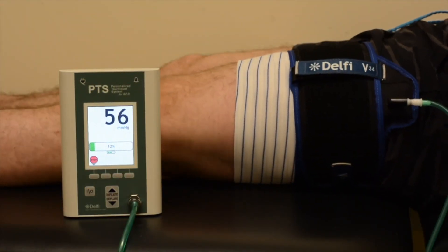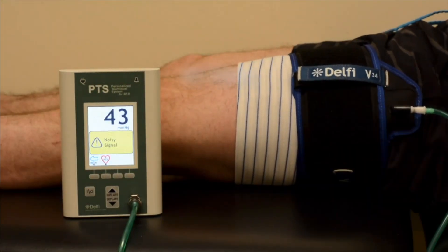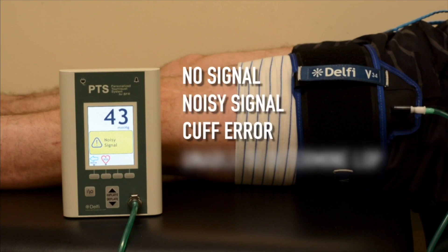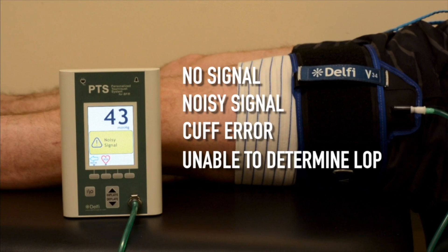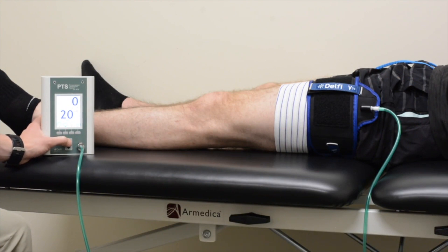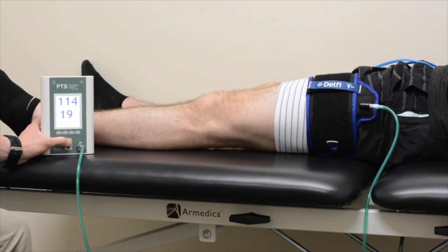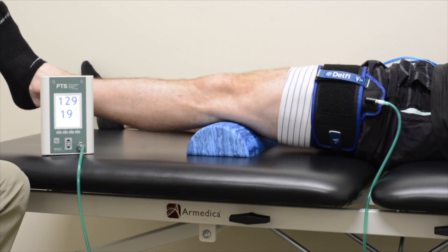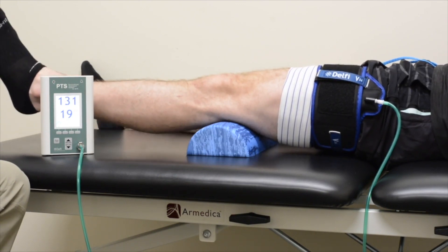If at any point a signal error is displayed — either no signal, noisy signal, cuff error, or unable to determine LOP — check the hose connection, reapply the tourniquet snugly, and repeat the personalized tourniquet pressure determination, ensuring no movement of the thigh, pose, or tourniquet system occurs. BFR may be prescribed for patients in either post-operative condition of restricted weight bearing or full weight bearing.